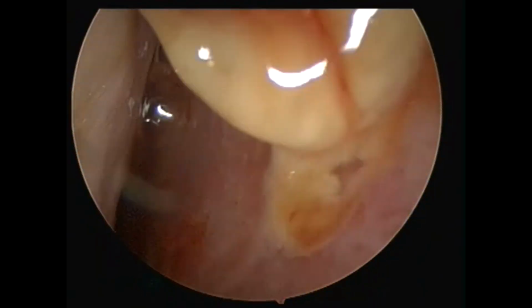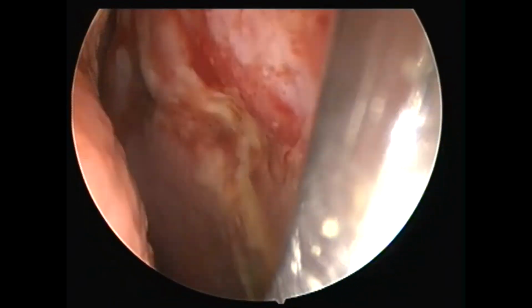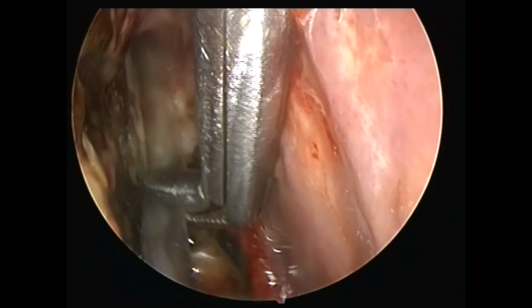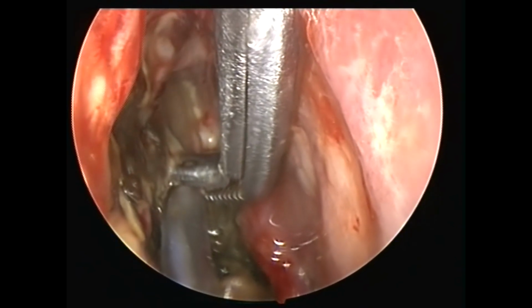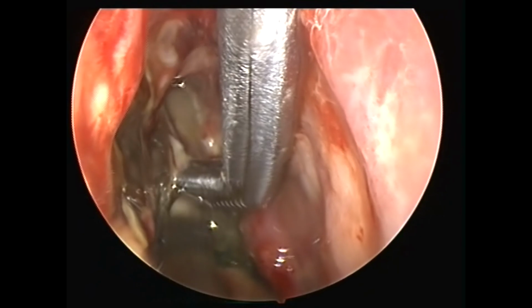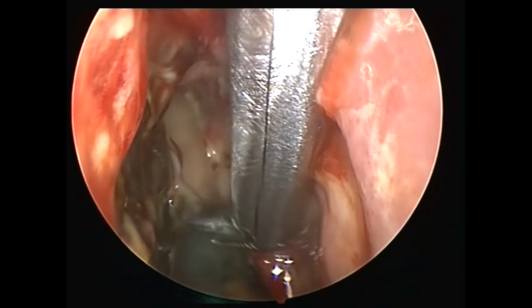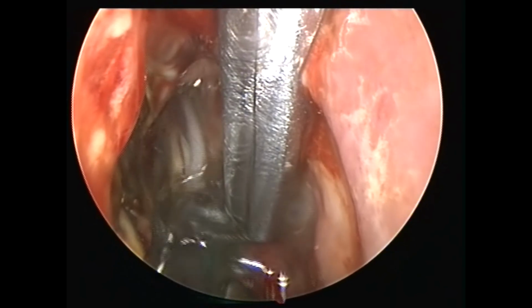The next step would be to take an upward forceps. You have to make sure you use the 70-degree endoscope very gently, the way I'm using it right now. And now you're going to take your upward Blakesley, grab hold of the tube and just push it upwards exactly into the depth of the frontal sinus. And now you can ask your assistant to flush normal saline or Ringer's lactate mixed with budesonide inside the frontal sinus. Can you see that? So make sure you go for constant washes, 2-3 times at a single go, and that's going to take away whatever debris is left behind in the frontal sinus very easily.